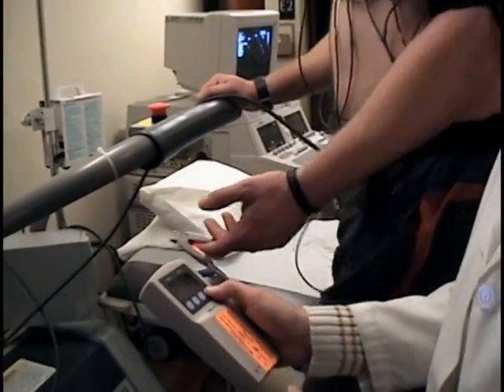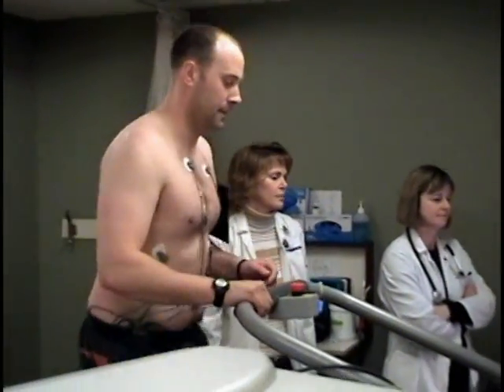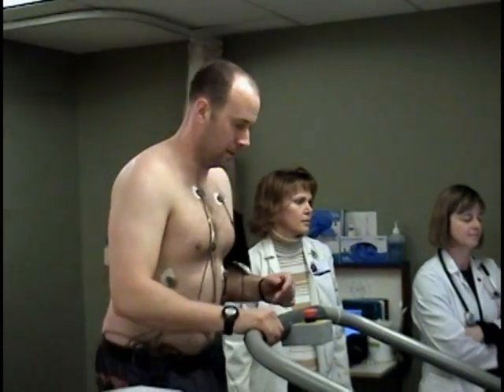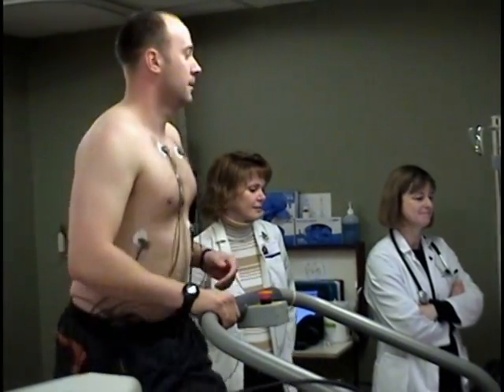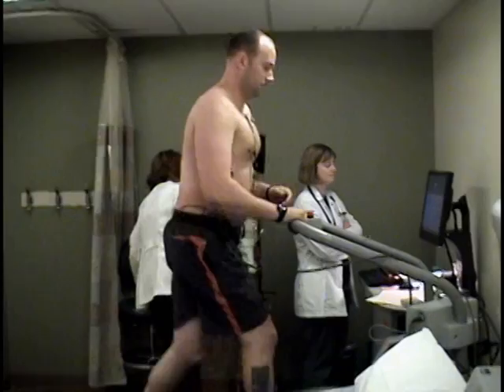Our staff will continue to monitor your vitals as you exercise. If at any point in the test you feel that you cannot continue, have chest pain, are dizzy or nauseous, please notify our staff immediately. Otherwise, they will allow you to continue to exercise until you reach your target heart rate.